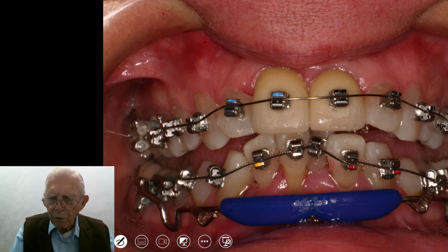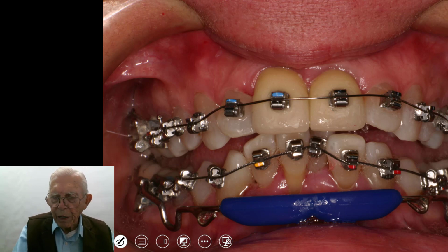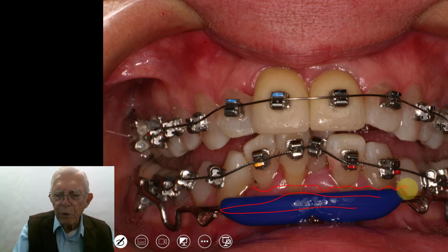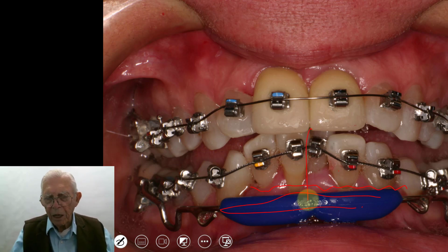I usually use 2 arch wires, and put a lip bumper, just made out of 018 arch wire, in here. When you put this in, it pushes forward, and you've got some space between here and the teeth. And now we're going to try to lower these teeth. We're going to open the bite and at the same time bring the teeth forward.